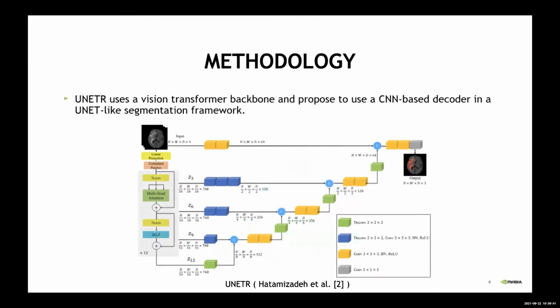Getting a little more into the nitty-gritty of the details, you can see that we can feed in 3D inputs with multi-modal information, such as these brain images. They have 4 modalities, and you directly input this into our volumetric linear projection layer, and we project this into an embedding space.